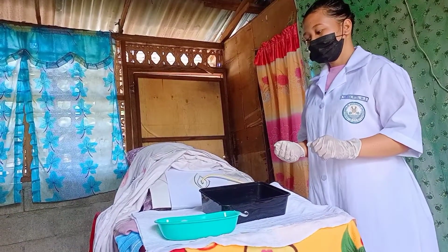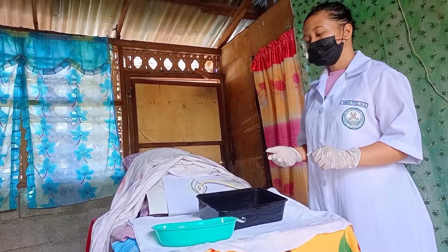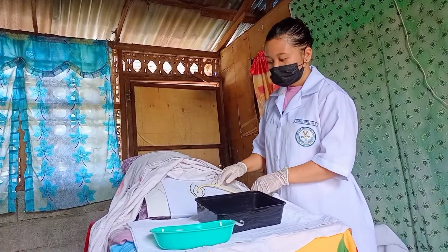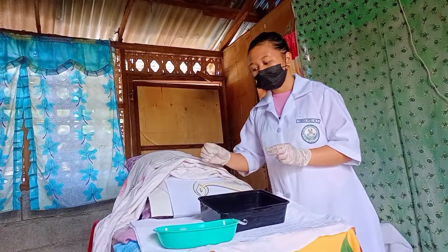And also clean the client's perineal area as needed and dry. For this, remove the residual antiseptic solutions from the area.